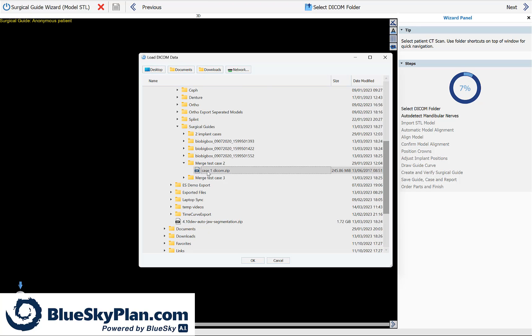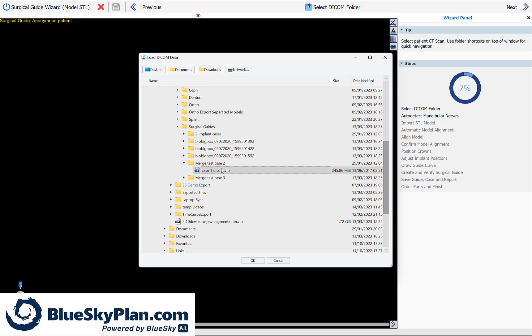Blue Sky Plan was built to be as versatile and robust as possible. You can load compressed DICOMs, uncompressed DICOMs, zipped DICOMs, unzipped DICOMs—almost all the possibilities of existing DICOMs can be loaded into Blue Sky Plan. Select the relevant folder or file by clicking with your left mouse button and click OK.